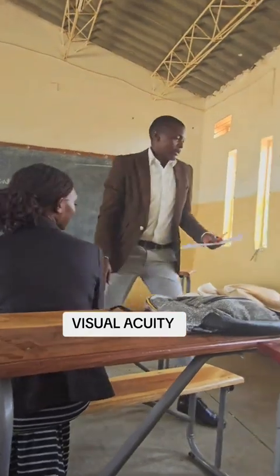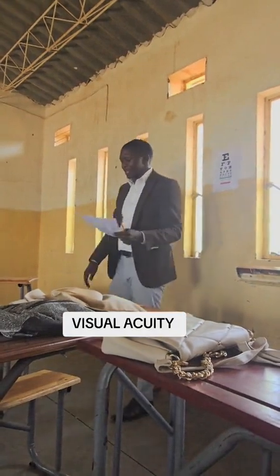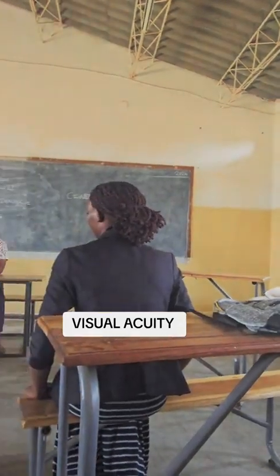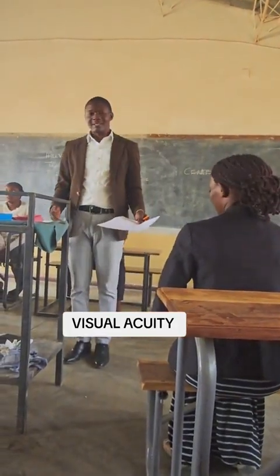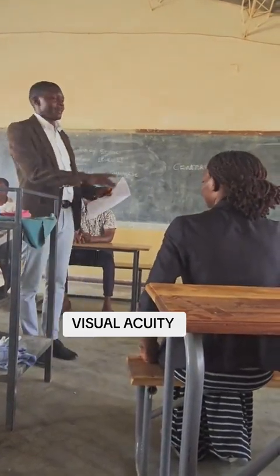Okay. So at this moment, the owner of the procedure, you go where the chart is, you just count. Sometimes the room is small, so don't say, no, I need 6 meters. Just do even 4 steps and then you say, okay, this is 6 meters. So Miss X, I will ask you to just stand a bit here facing the chart.